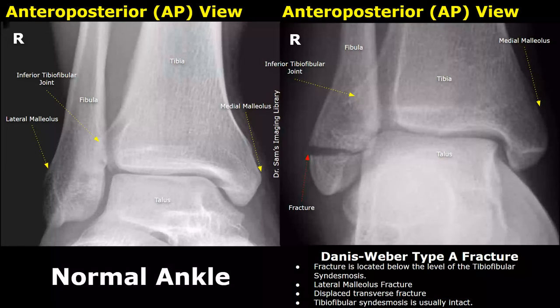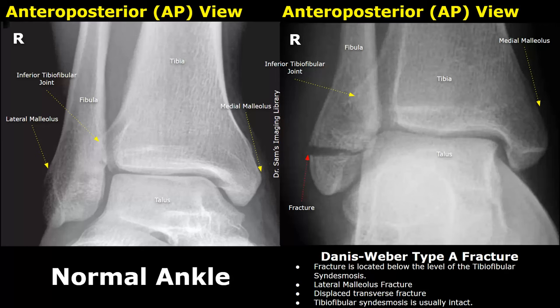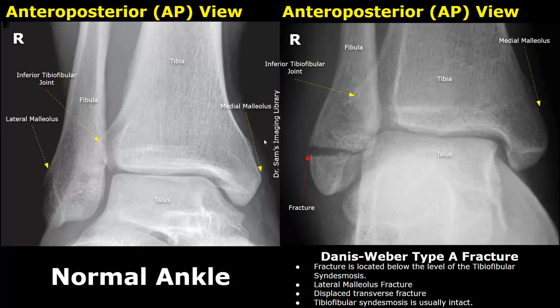Hello everyone, this is Dr. Sam. This video is about the Danis-Weber classification of ankle fractures on X-ray. The Danis-Weber classification is a system used to categorize ankle fractures, particularly fibular fractures, based on the level of the fracture in relation to the syndesmosis — the joint where the tibia and fibula meet at the ankle. This classification helps in determining the stability of the fracture and the appropriate treatment approach. It includes three main types: Weber A, B, and C.